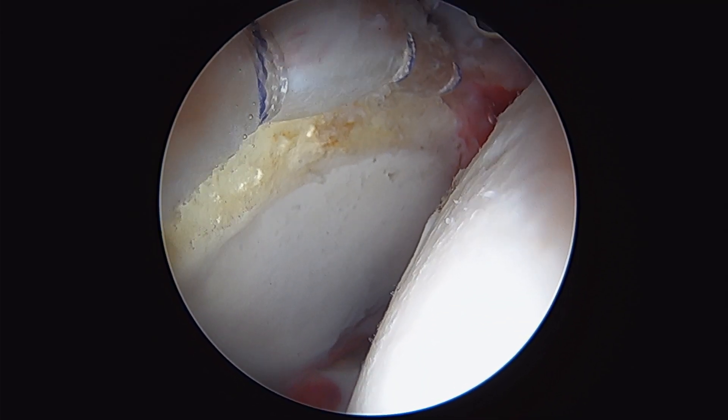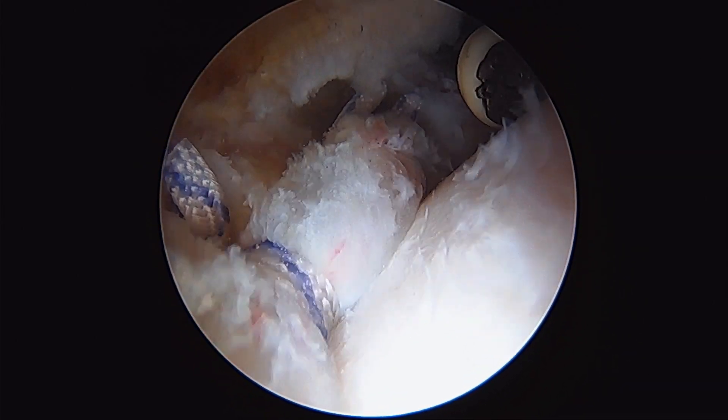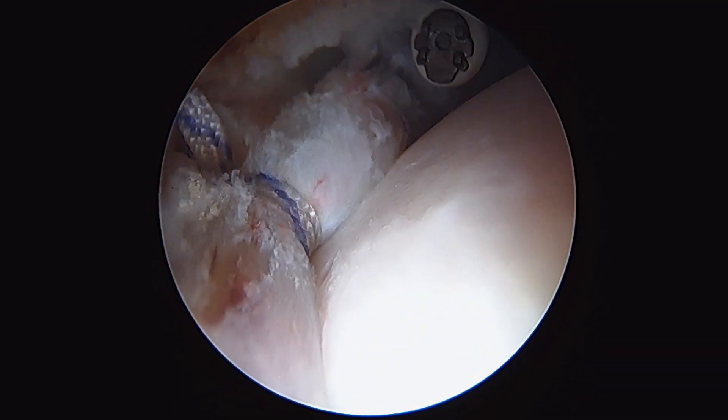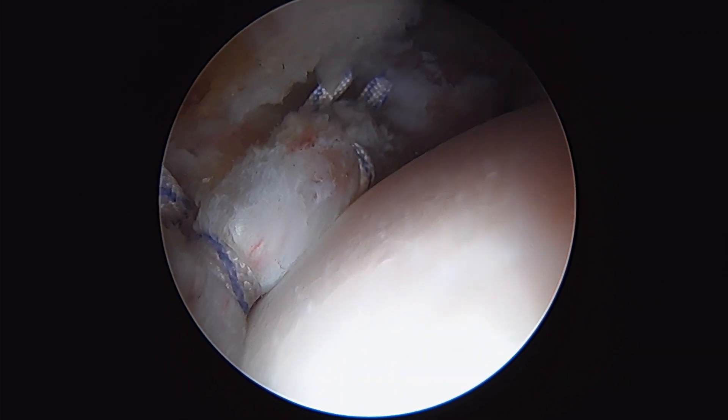You're going to see the hip coming back into the joint here. Femoral head's back in. You can see the labrum hugging up against the head for that suction seal. And that looks great.